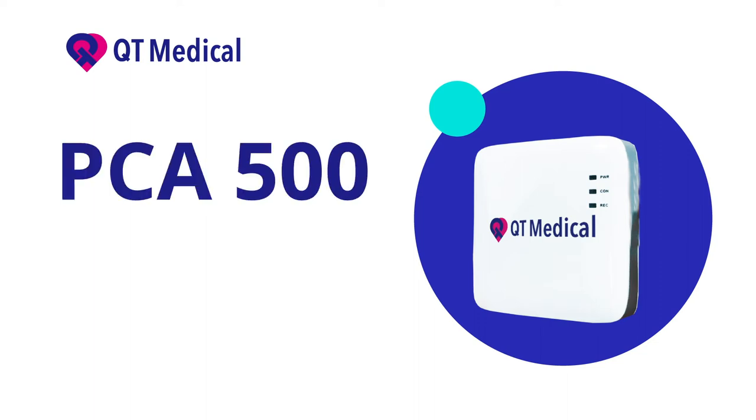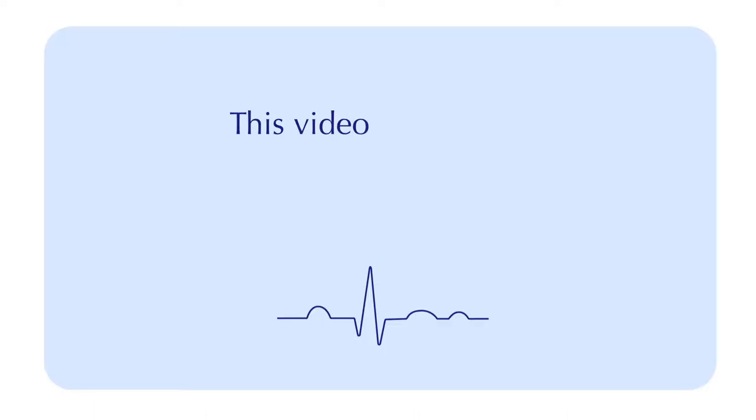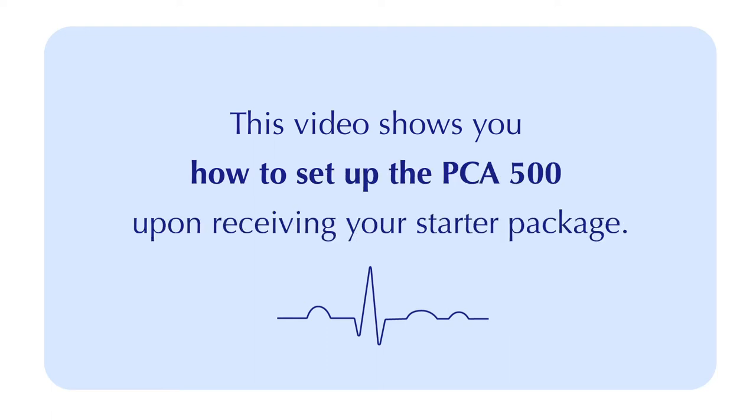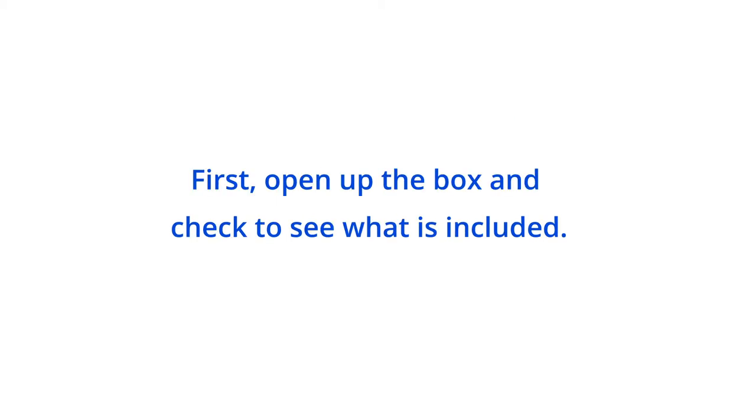PCA 500 - Upon receiving your order, this video shows you how to set up the PCA 500. Step 1: Checking what is included in the box. First, open up the box and check to see what is included.